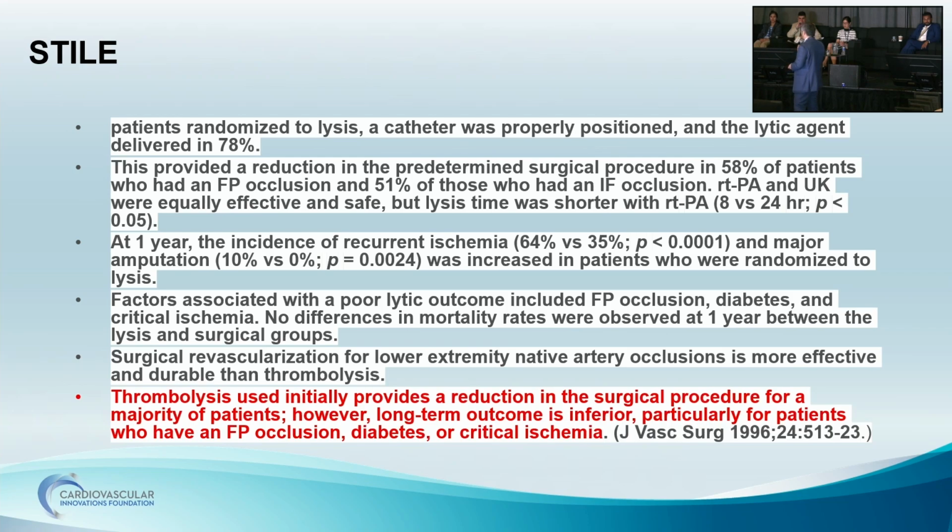So the question is, is it because in 1996 we didn't have the right device? Are we lysing too short? Should we lyse longer? Or do we just have better surgical approaches? At that time, all acute limb ischemia went for surgery based on this study.